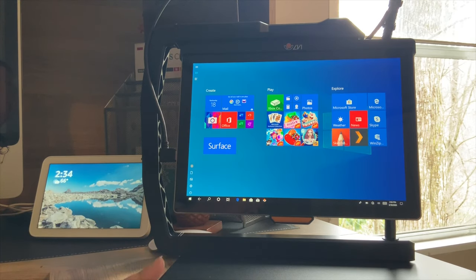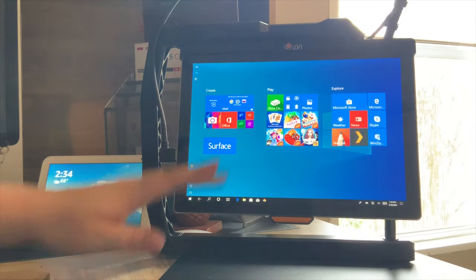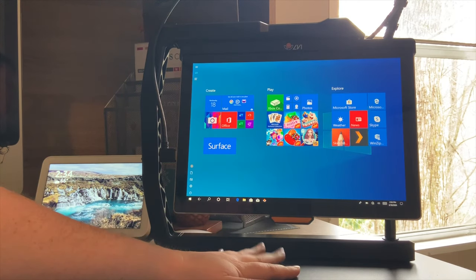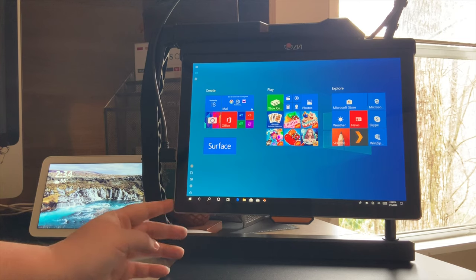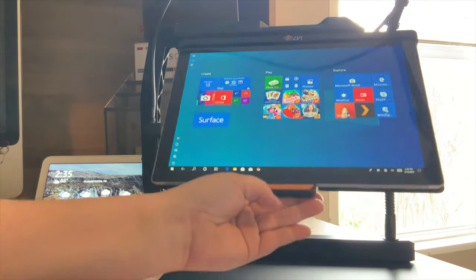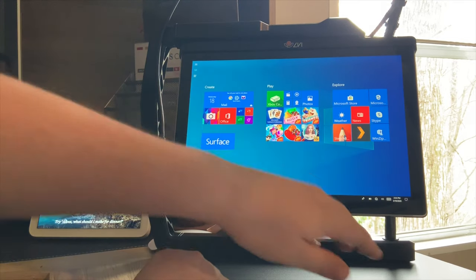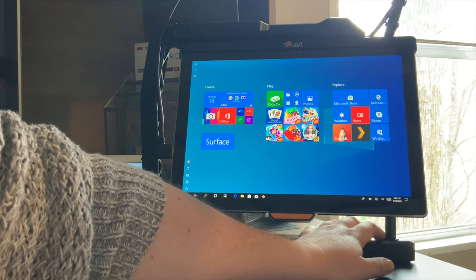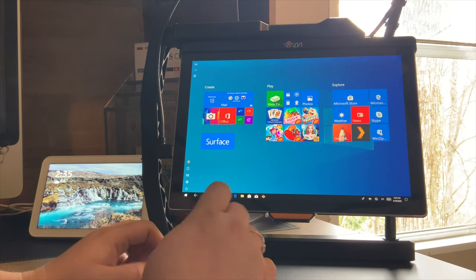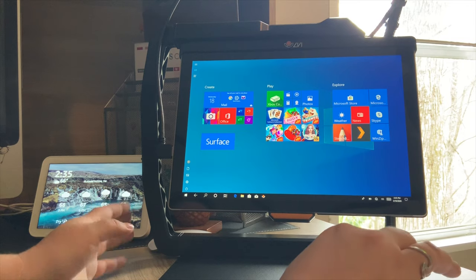Hey guys, so we're going to go ahead and get started. As you can see I have my Magna Link Tab set up here. I also have my camera installed in the base and the tablet pulled up. You'll see we have our stand — there's a large metal plate at the bottom on my desk, and then we have our Surface tablet hanging from the top. This does swivel, so I can use the piece at the bottom middle to adjust it to my viewing pleasure.